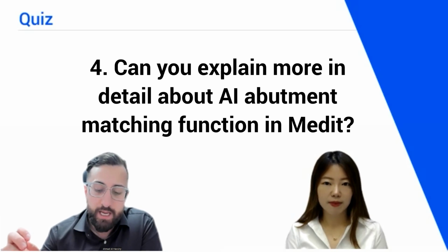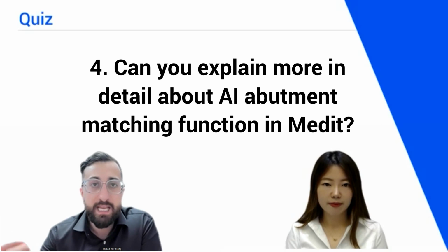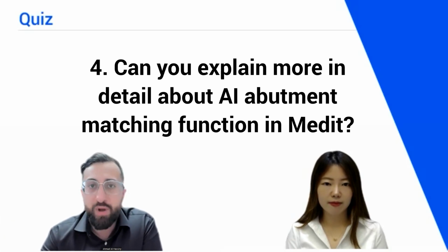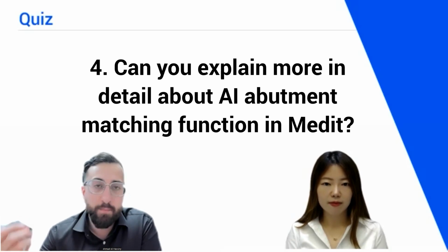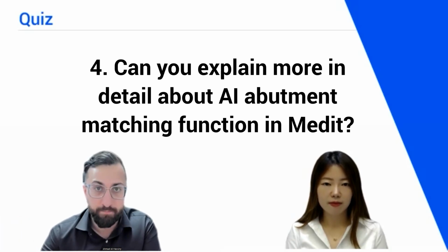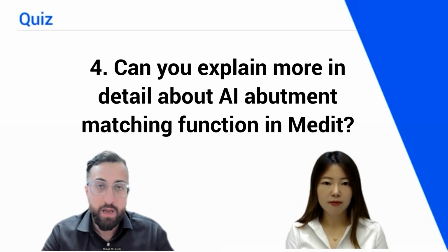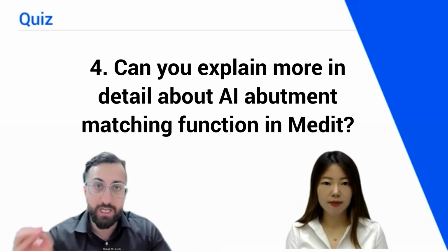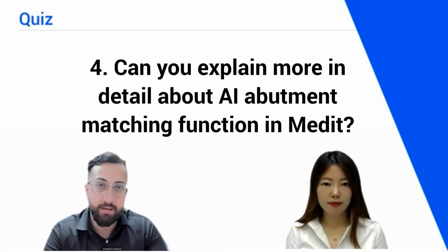So what the Medit software enables you to do is import that library into the software. And where do you get that library? From the implant companies. When you import that library into the software, when you're scanning, it will automatically tell you if it's been able to join the digital analog to your scan.